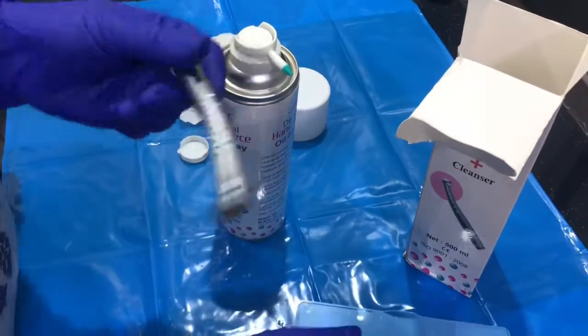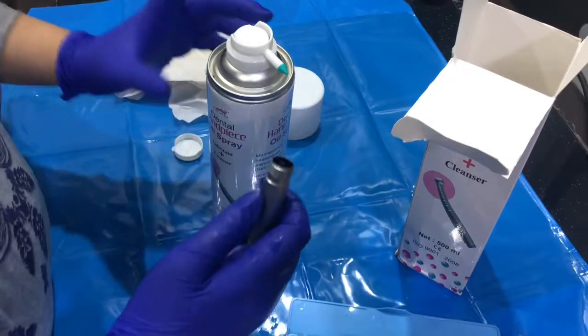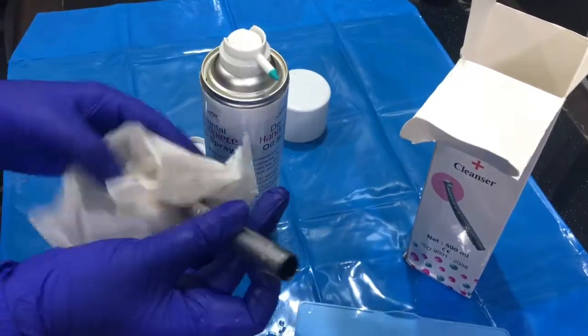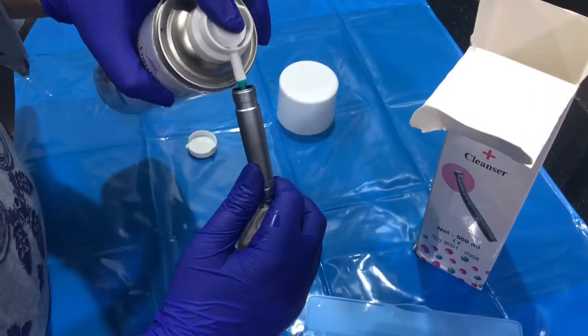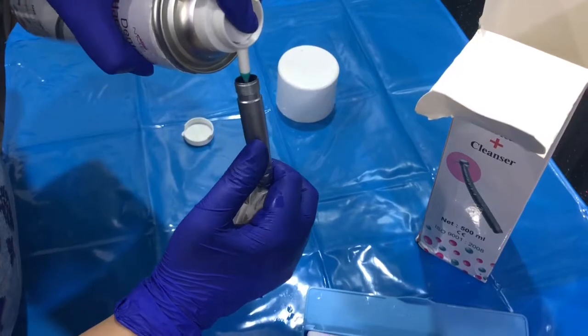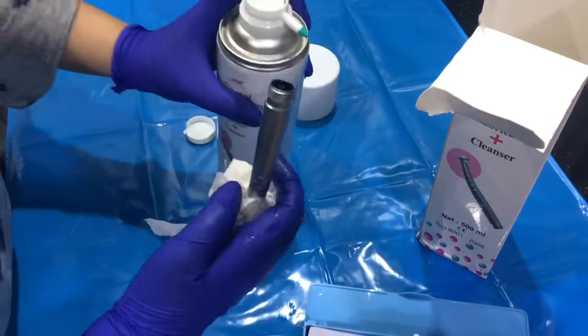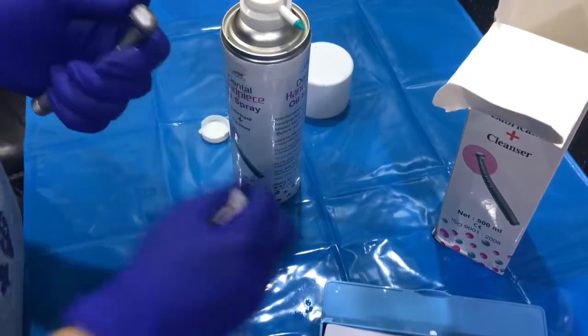This is a handpiece from Nexus Menodent NMD. Let me show you how it works — you have to put it here. You can even use it in the front as well.